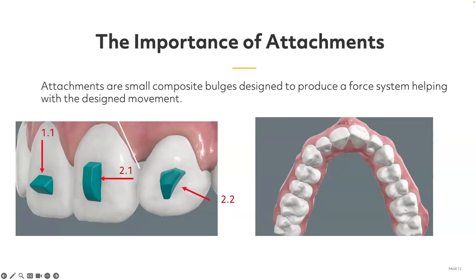So this is called a multiplane attachment because you can see it has a lot of surface that can be activated during the treatment plan. That means at some point I make the rotation, but I also will need a tip. So the forces are not going to pass through this way anymore. It can change and pass through another part of the attachment. So that is why there is a multiplane or multi-surface on this attachment.